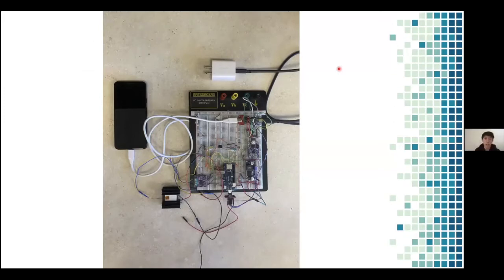So by realizing the diagram, we have our prototype board. Our prototype board is too large and too messy to fit in a handheld system. So we need our PCB design.